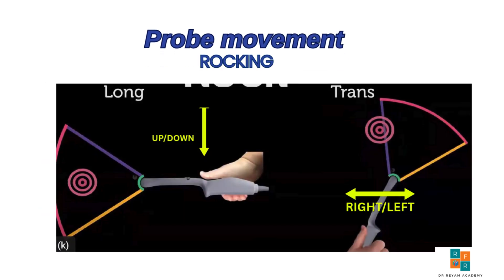It's important to understand how to move the probe correctly. One key movement is rocking, which involves tilting the probe along its longitudinal axis. This adjusts the field of view and helps in visualizing different structures. In the longitudinal view, rocking means moving the probe up and down. While in the transverse view, rocking means tilting the probe side to side.